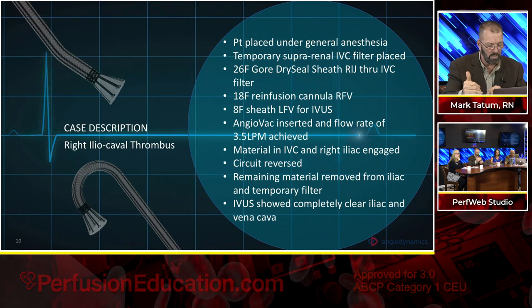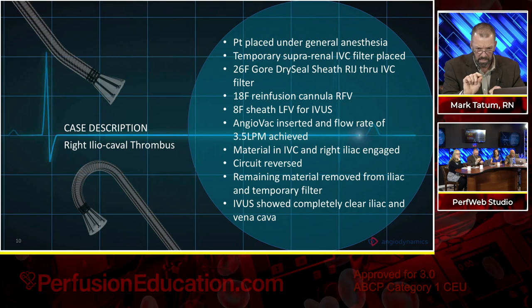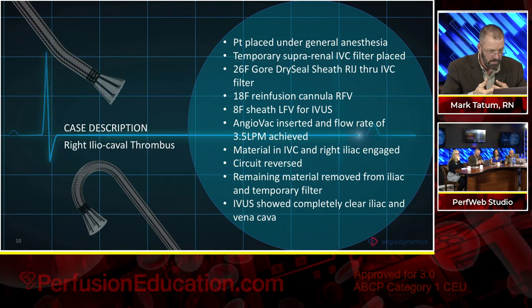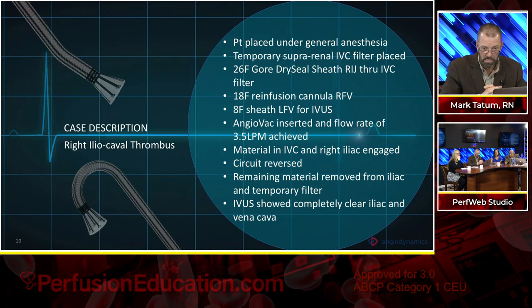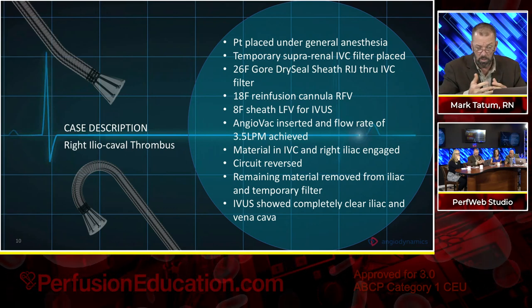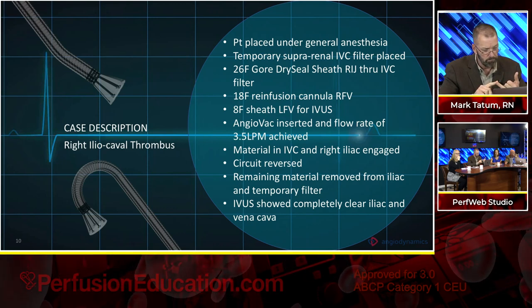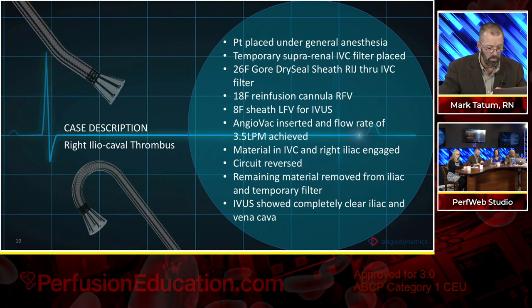I am going to mention the last thing. Everybody's had plenty of time to read this setup. The IVUS showed completely clear. So intravascular ultrasound is one of the things that we find used in these cases sometimes. Personally, I'm a huge fan. Less contrast is better. Less rads are better, so less gray is better. So you have the option to view live in real time exactly what the effect of your treatment strategy is going to be in the utilization of IVUS. And you don't sacrifice renal function or the exposure to significant amounts of radiation under fluoro when you're able to use that. So let's go to the next slide.